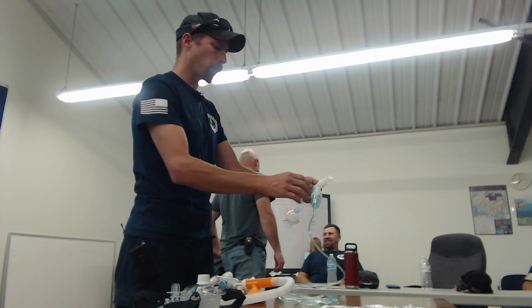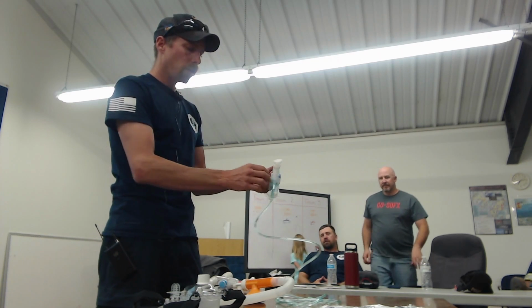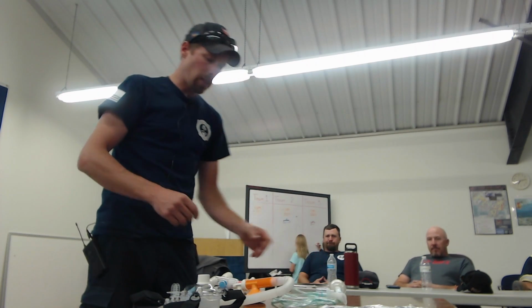Not necessarily all these parts. This is a fully assembled nebulizer from another kit, but you will get the nebulizer chamber, the T, and the stuff you will need to hook it up to the CPAP machine itself. But it's going to come out of the bag. It's going to be fully assembled.